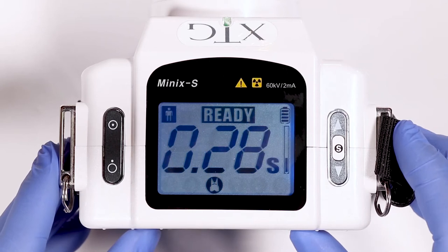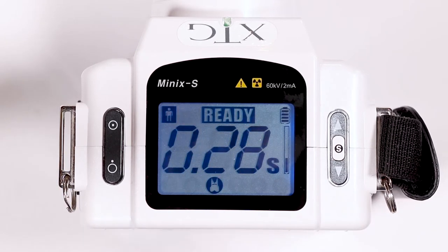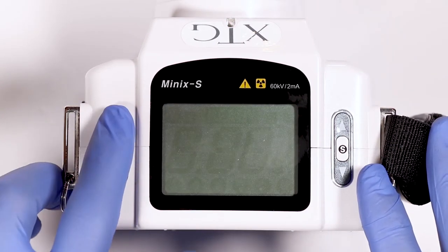the full battery life. Exposures, you should receive about 150 exposures throughout the day or the life of the battery before it needs to be recharged. The factory settings on XTG are set as a starting point.